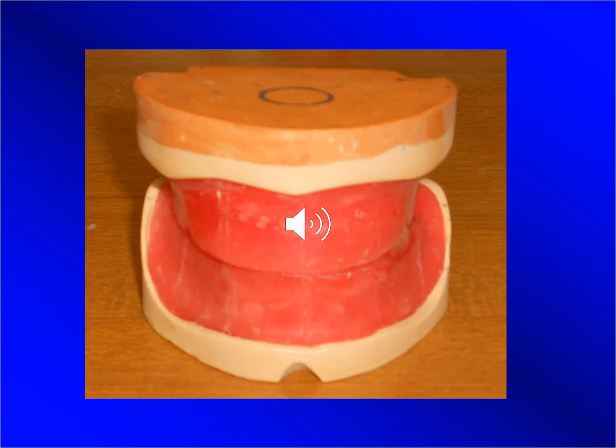As you can see here, the upper and the lower master casts were related to each other using these two bite blocks, after being adjusted properly inside the patient's mouth and used to make the relation between the maxilla and the mandible. But before we proceed to the next step, this relation should be kept and should be used to relate the two models to the articulator, which is the topic of today's lecture.